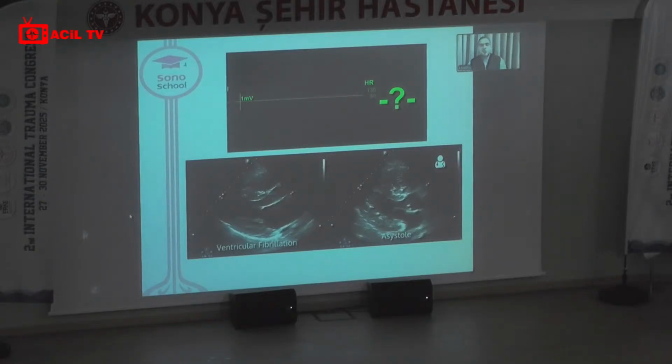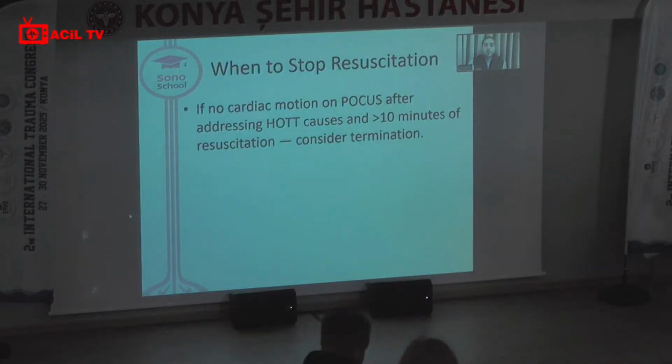So, I will change the algorithm from the non-shockable algorithm to the shockable algorithm. I will give a shock because this is a fine VF that the monitor can't detect, but the ultrasound can. So the FOCUS has a great role in traumatic cardiac arrest.